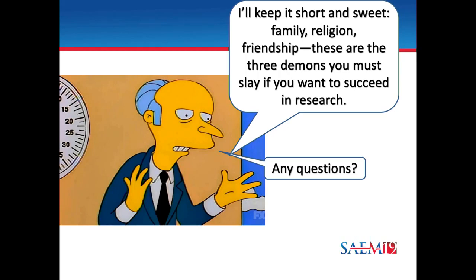So half of it will be like that anterior wall. Like, I just chose the wrong anterior wall segment. If I had chosen a better one, it would have been fine, but it was instructive. So half of them that we toss, of the 10 to 12%, will be for quality. And it's usually the anterior wall, or it's usually the lateral wall because of the lung. And then the other half, it's because of some technical ridiculousness.